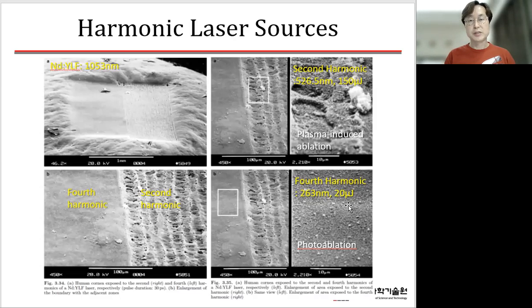So here, as you can see, it is very important for any kind of cornea shaping, which is LASIK, by using the laser. In that case, you have to use the photoablation interaction, which uses that short wavelength.